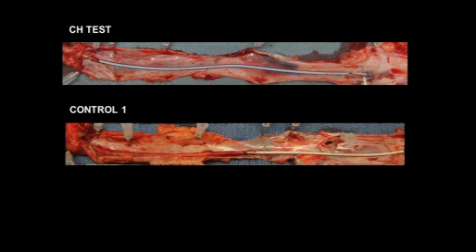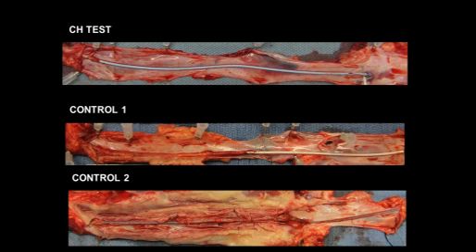So in summary then, we look at the effects of both the antimicrobial and antithrombogenic effects of the chlorhexidine test catheter compared to the uncoated control and compared to the predicate device.